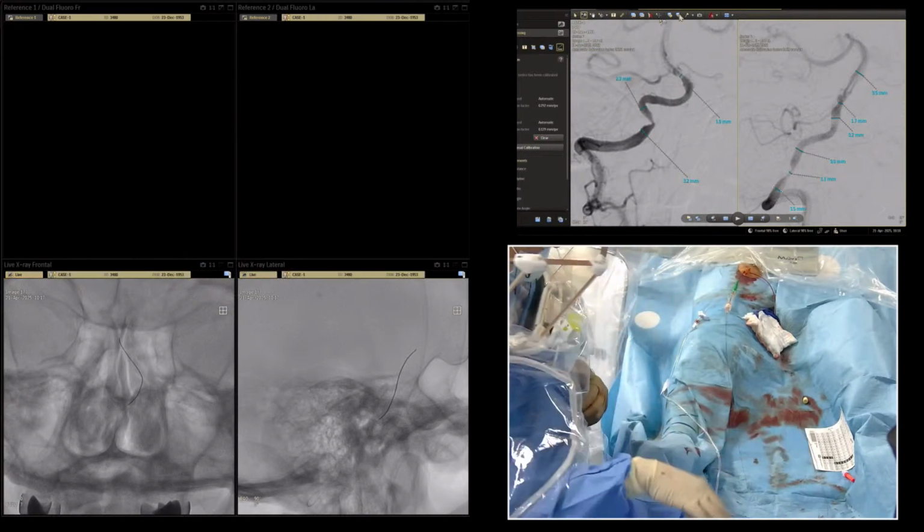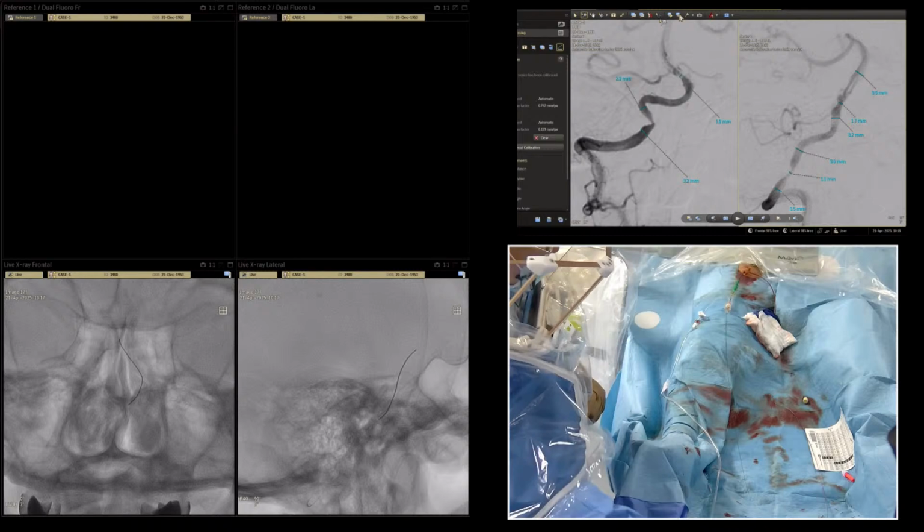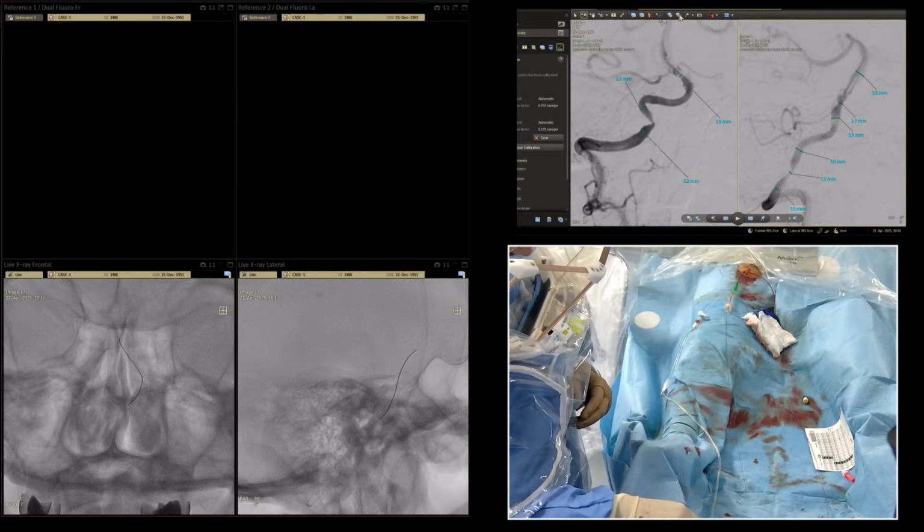Бізде солитр бар ма? Полкада жатқан солитр бар ма?